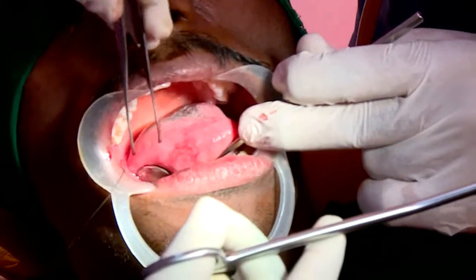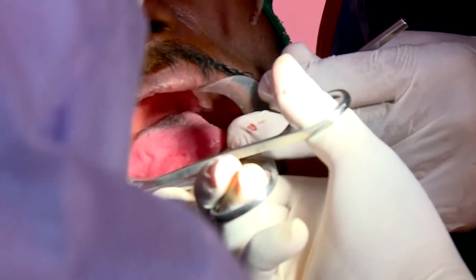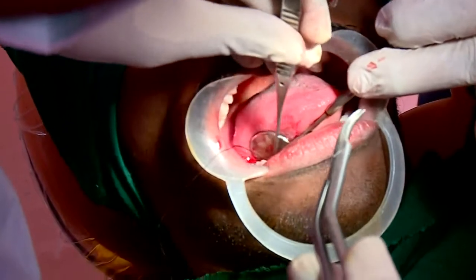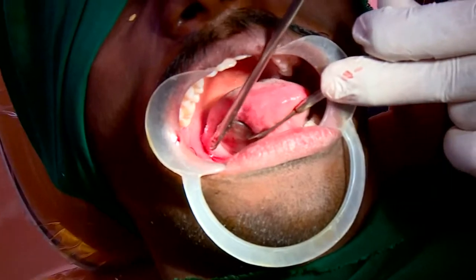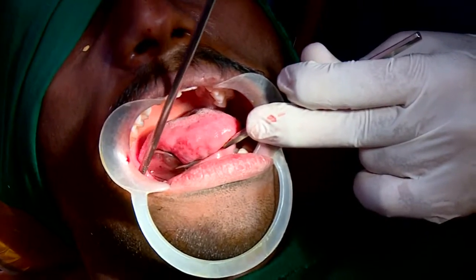After the sutures, a moist gauze or cotton is placed, and the patient is told to bite on it for around 40 minutes to an hour. Depending on the time period, you tell the patient to use adequate analgesic. Okay?